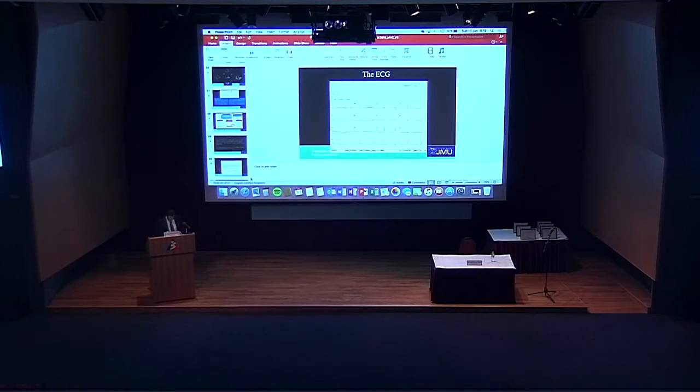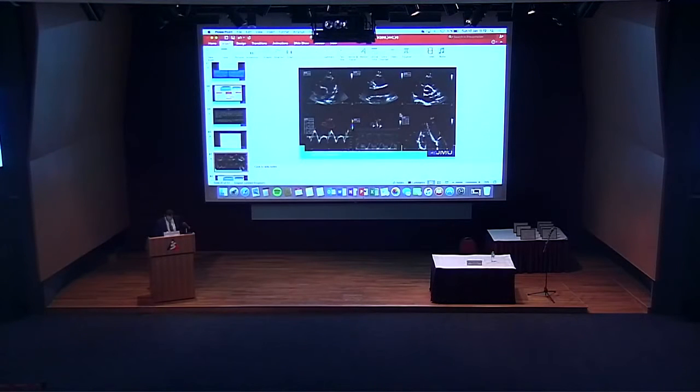So hopefully the echo will work if I move down here. These are all stills. We did the measurements. We're measuring 29 here, 33 here, 31 here. I think that's measuring 54. 54 at D1 here. These measurements here are all above what we consider normal. And in fact, more so, this measurement here fits the minor criteria for ARVC.